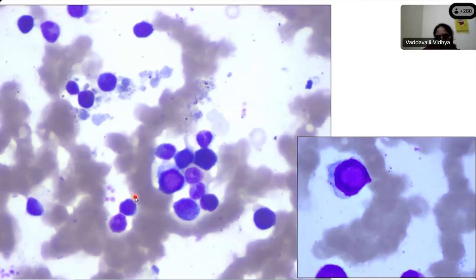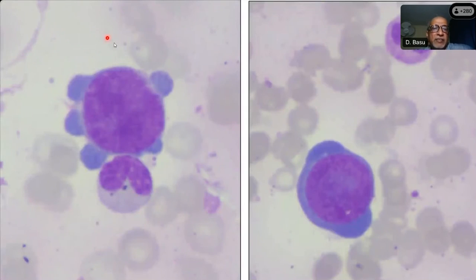What is the importance of noting these inclusions, big intranuclear inclusions? Infective cause, maybe parvoviral infection. Yeah, possibly. That we can keep in mind. Parvoviral infection, right? Yes, sir. Fine. Good. Again, I just wanted all of you to appreciate these large cells.